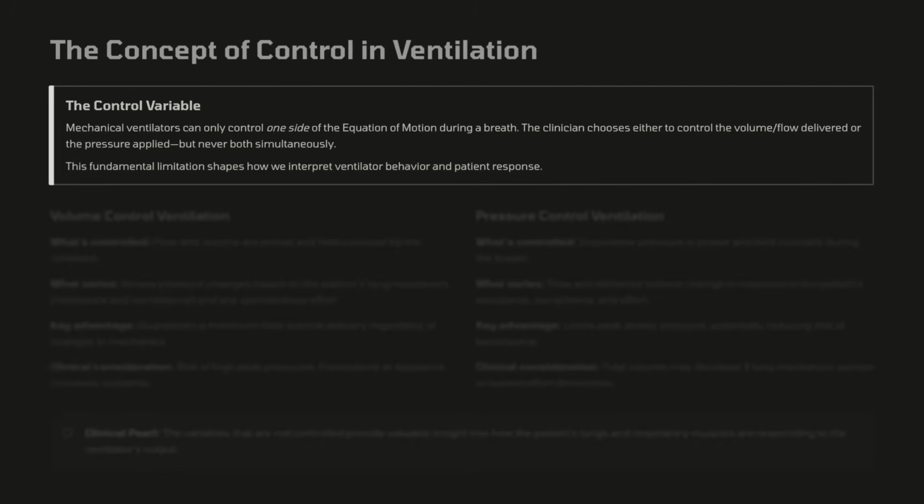So the mechanical ventilators can only control one side. The clinician chooses which one. Okay, so it can never be done simultaneously. You cannot control both the sides. It's just not possible. This fundamental limitation shapes how we interpret the ventilator's behavior and the patient's response.